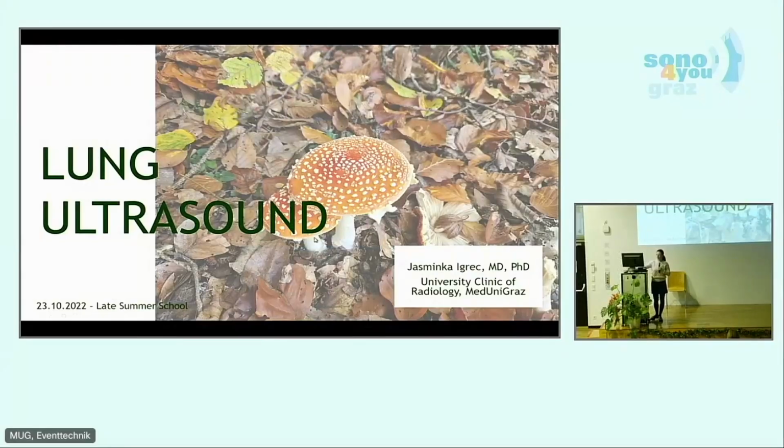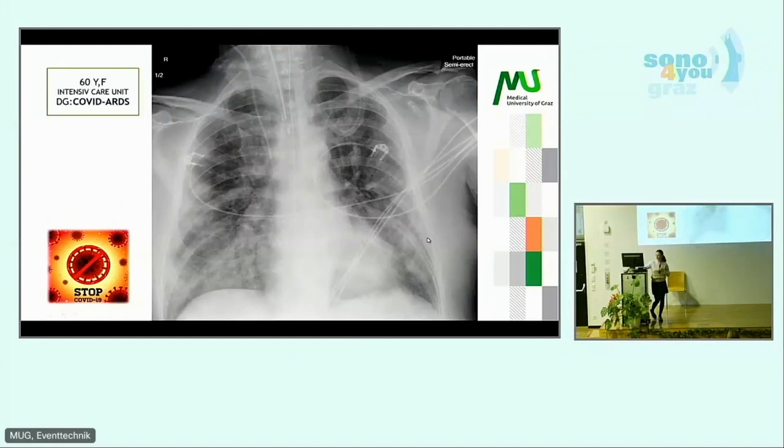So I will start my lecture about lung ultrasound with a case. It's a 60-year-old female patient lying in the intensive care unit, and she has a COVID infection. She's doing really badly, and she developed acute respiratory distress syndrome.